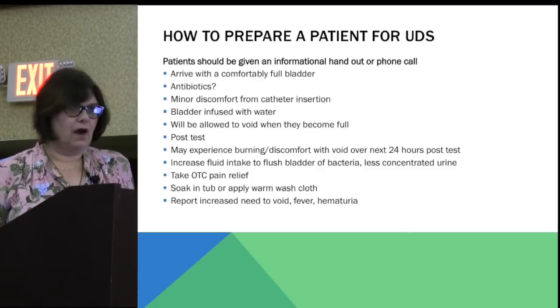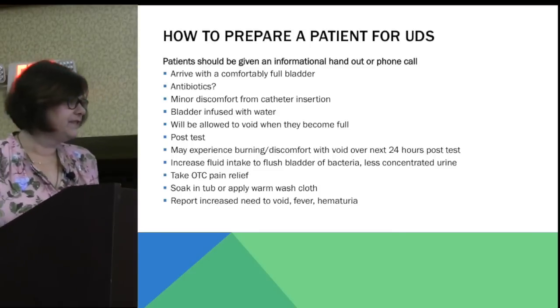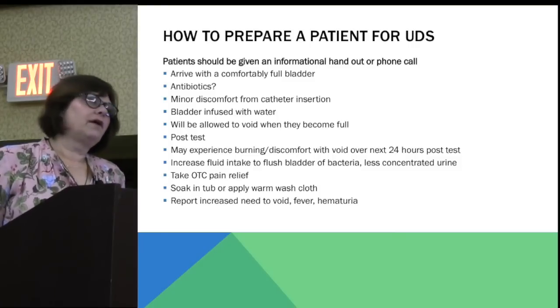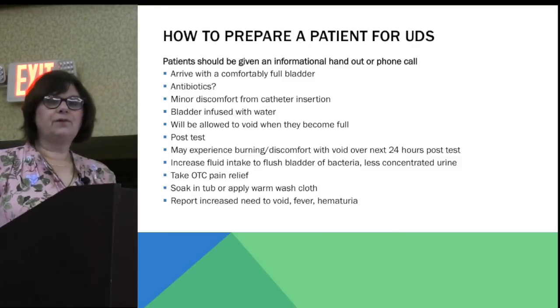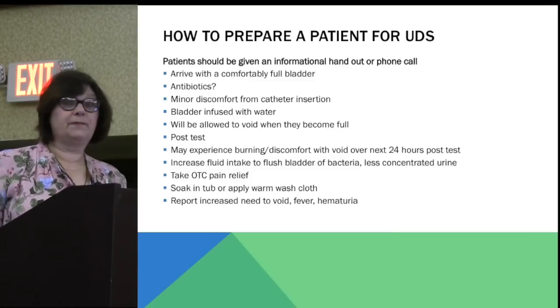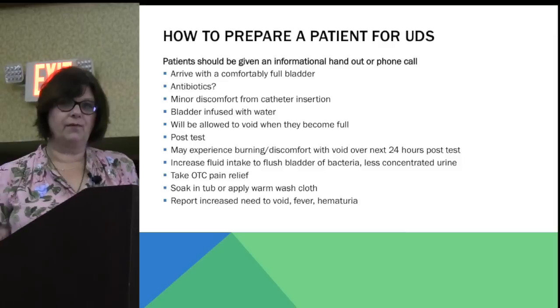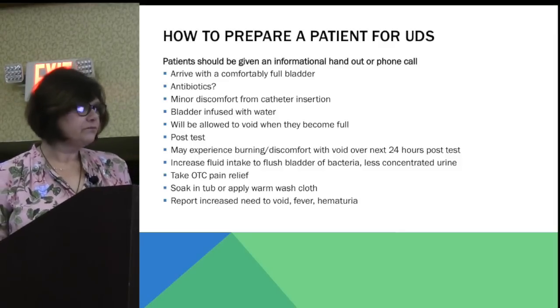So how to prepare your patient for urodynamics. There's probably 50 different opinions, but these are just some of the generalizations. You want your patient to arrive with a comfortably full bladder. You're going to do your best. Hopefully the people who are checking patients in let you know, your urodynamics patient is here, their bladder is really full, so we need to get them back so that we can do their uroflow. We want to start with that. So they can come in, sit down, and urinate.